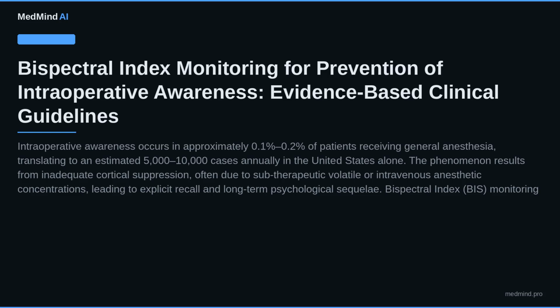Bispectral Index monitoring for prevention of intraoperative awareness, evidence-based clinical guidelines. Intraoperative awareness occurs in approximately 0.1% to 0.2% of patients receiving general anesthesia, translating to an estimated 5,000 to 10,000 cases annually in the United States alone.